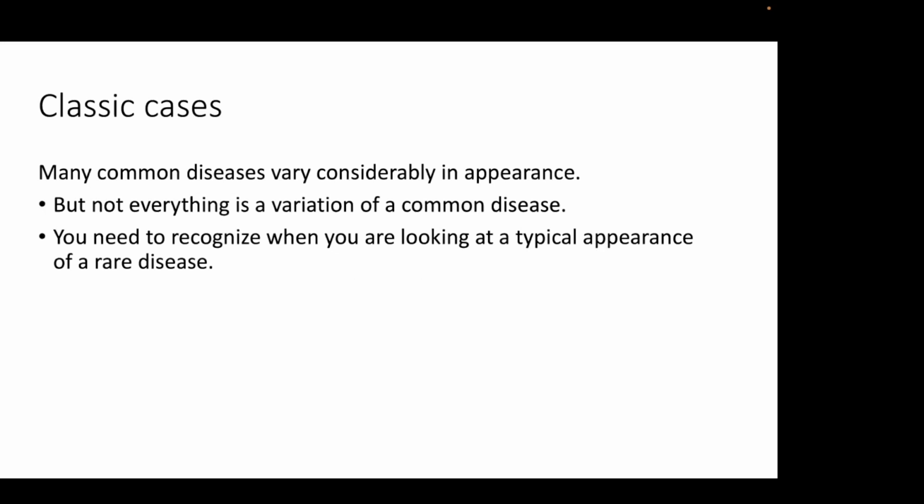Yeah, of course. If after all examination and seeing all sequences, we still have some doubt about whether it is really a capillary telangiectasia or not, when can we repeat the examination, or is there no need to? If we have suspicion after all examination, maybe it is metastasis or telangiectasia. I want to know when we can repeat the examination to see changes: 1 month, 2 weeks, 3 months?